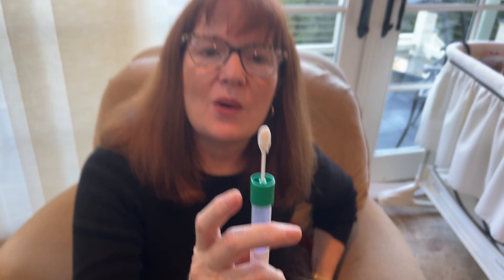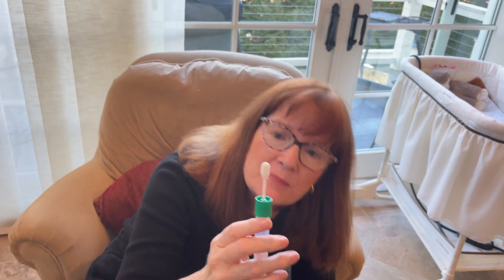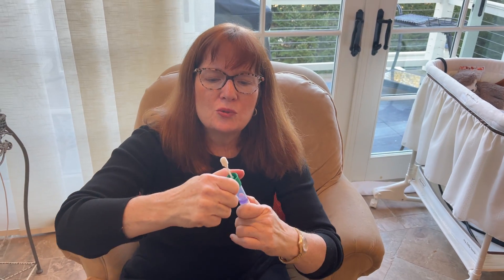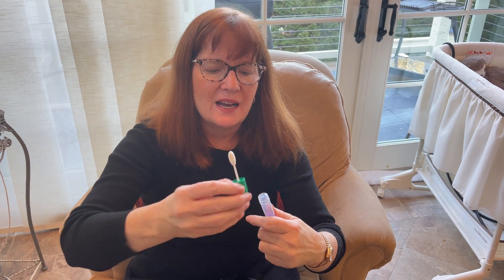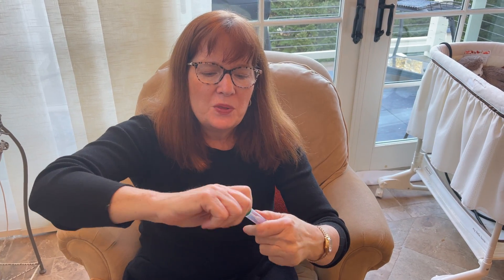Okay, so there we go — I think that's really good. Now I unscrew this. Easier said than done, but there we go, got it. And put that on, making sure it's on. And now I shake it — they want me to shake it at least 10 times.